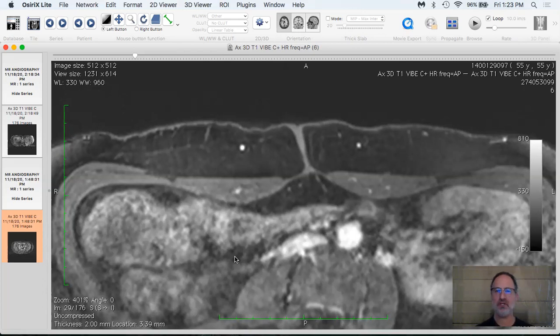So with the advent of imaging, we really began to enter an era in which we could plan the surgeries much, much more carefully, and it really enhanced our ability to offer the procedure and to be successful in the procedure in new ways. The first imaging for perforator flap breast reconstruction was done by a group in Barcelona, and they used CT angiography, or CT angiogram. And this was very, very revolutionary and very effective, and is still used in many centers today.